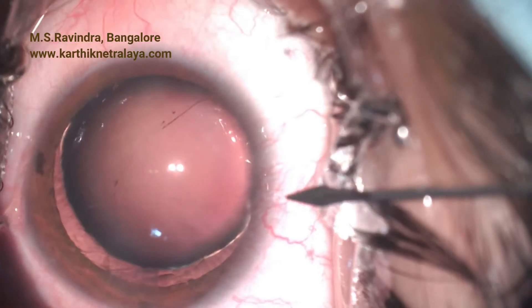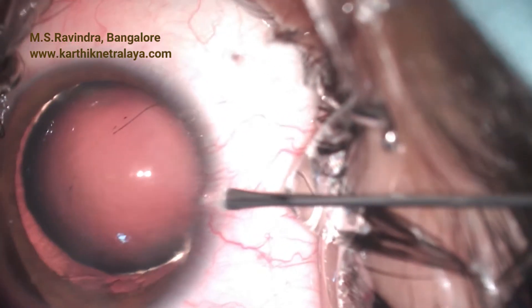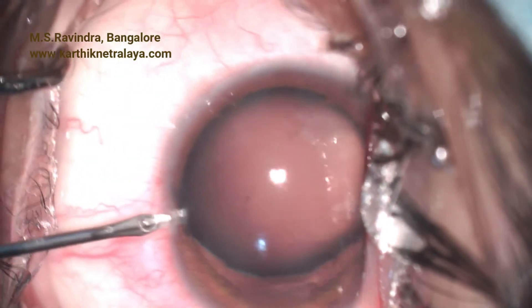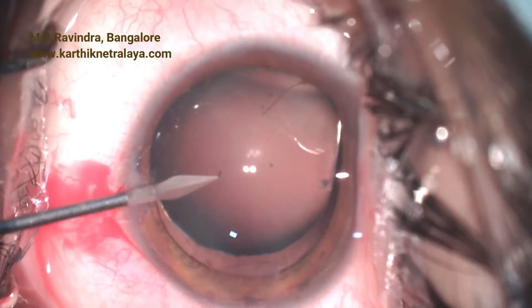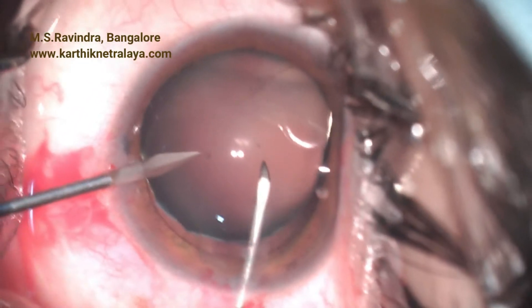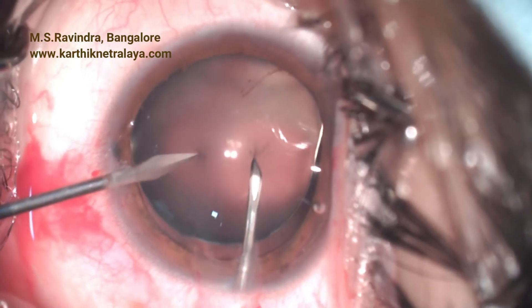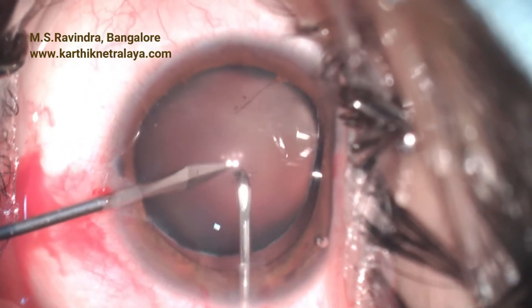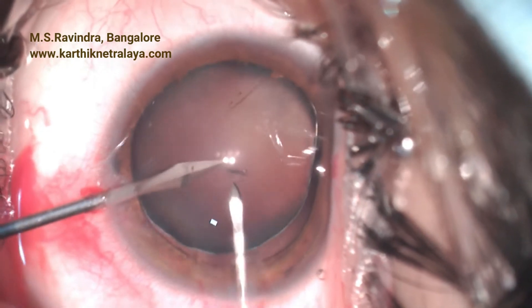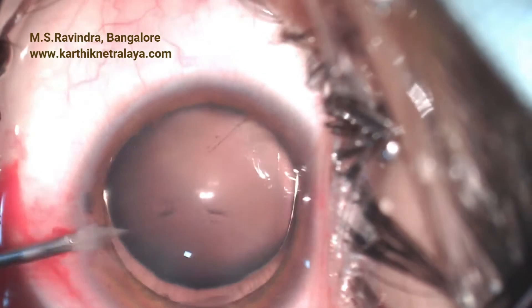A 2.8 millimeter keratome enters from the anterior sclera. Two MVR blade entries were made, and two punches were made with the MVR blade to facilitate capsular access.